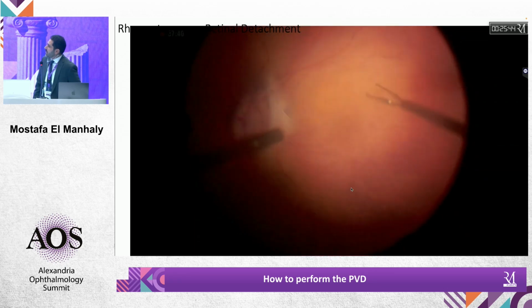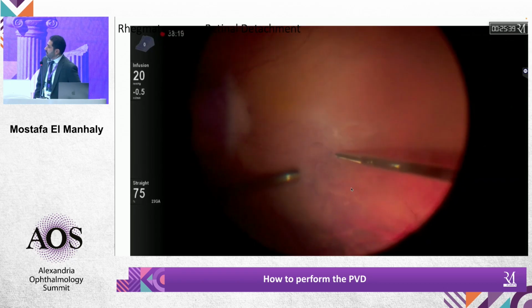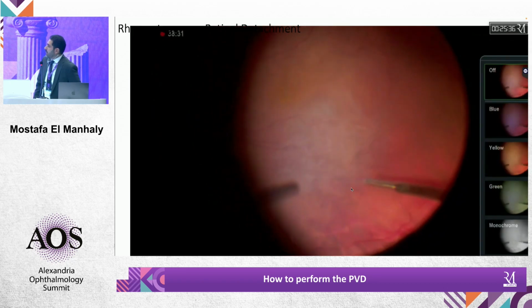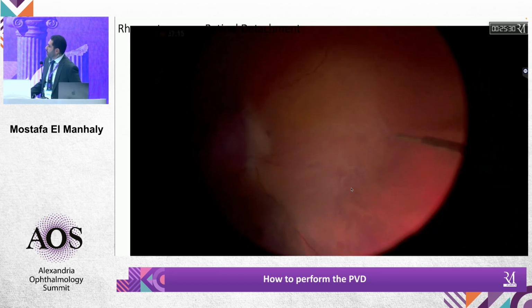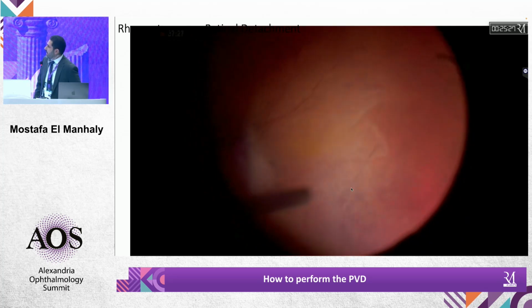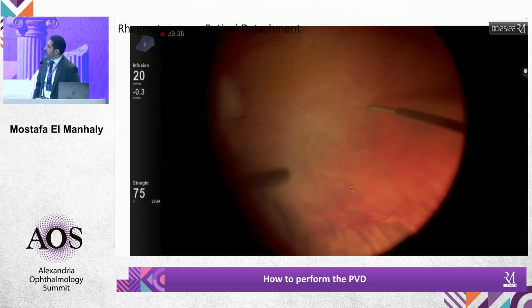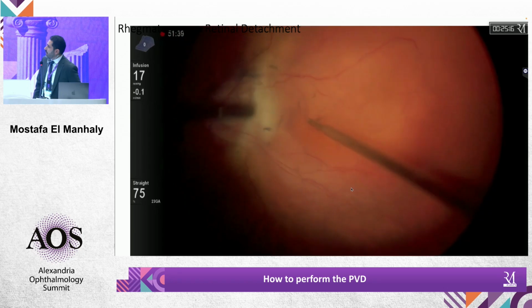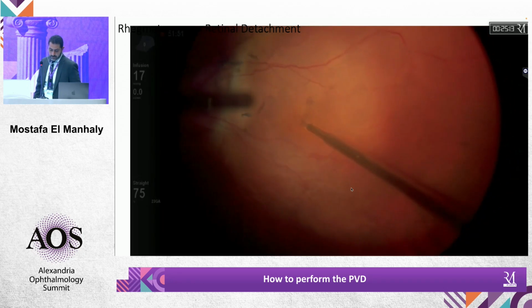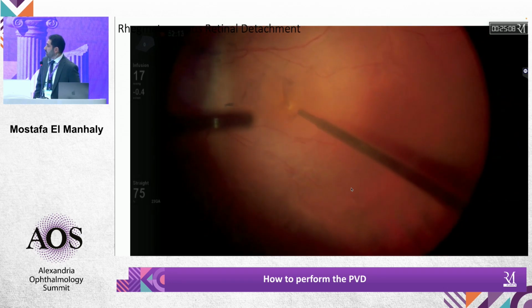Which stain will you use? Is it obvious with the BBG, or at this step you may add triamcinolone? You can use the blue dye, or you can use the triamcinolone, although I prefer the blue dye in these cases, because it gives a much better view. Again, it's the contrast of the choroidal atrophy. Would adding the filters of the digital era now help in this step? Yes, in these cases with some reflection from the back of the eye, I would use the green filter or the yellow filter, because it reduces glare and enhances the visualization of the tissues.